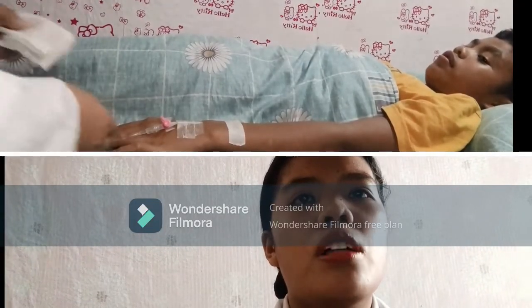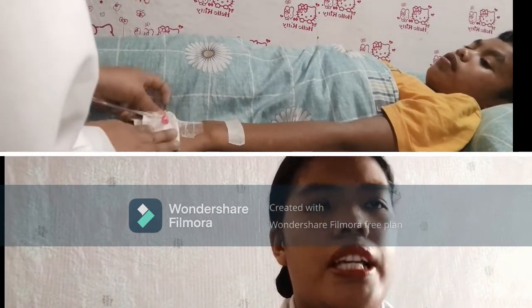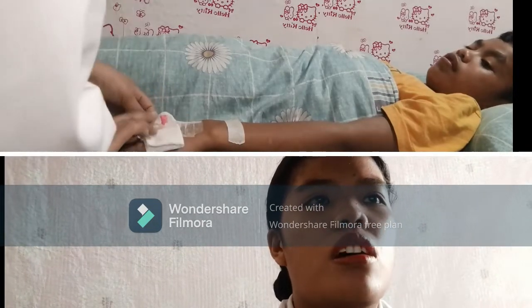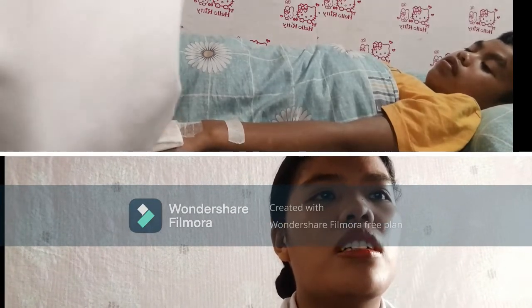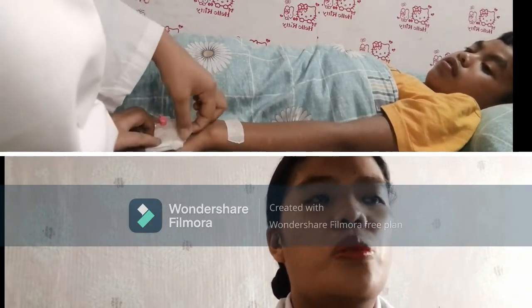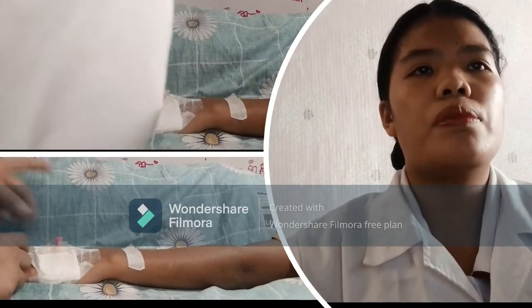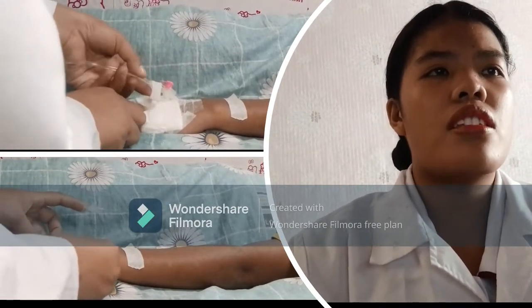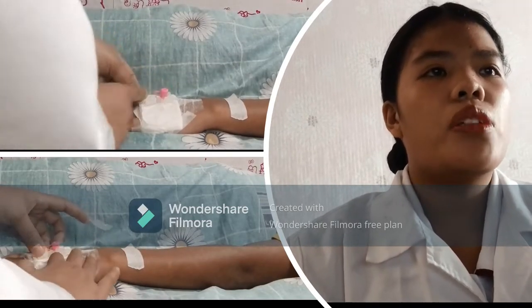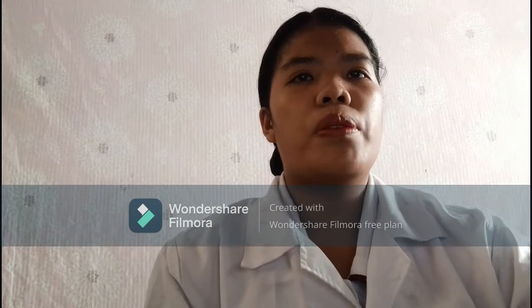Support the needle with a small piece of gauze or tissue paper under the hub, if necessary, to keep the needle in place. The smooth structure of the vein does not offer resistance to the movement of the needle. The weight of the tubing is sufficient to pull the needle out of the vein if it is not well anchored. Put the tubing near the site of entry and anchor it with plaster to prevent pulling of the needle. Lower the arm to an arm board for support if necessary.